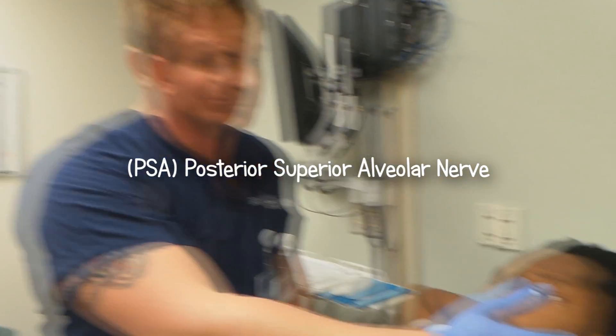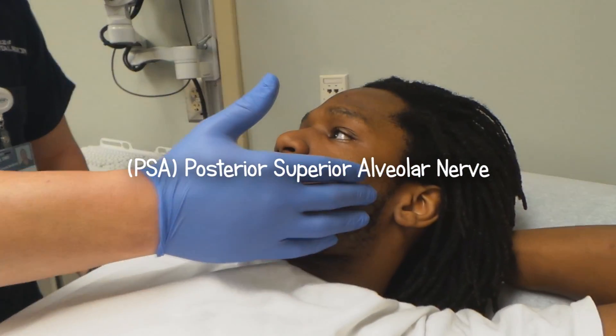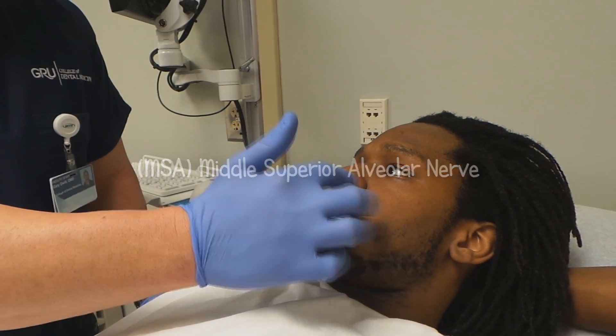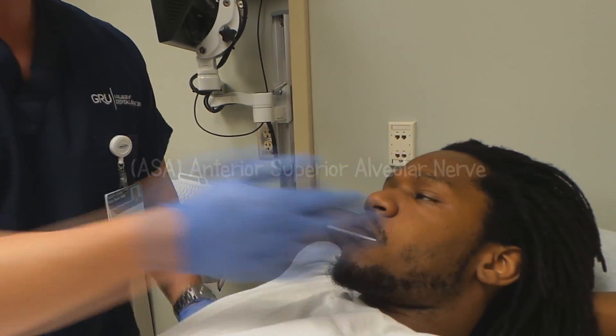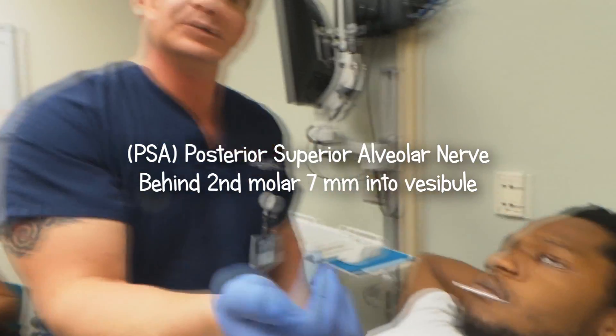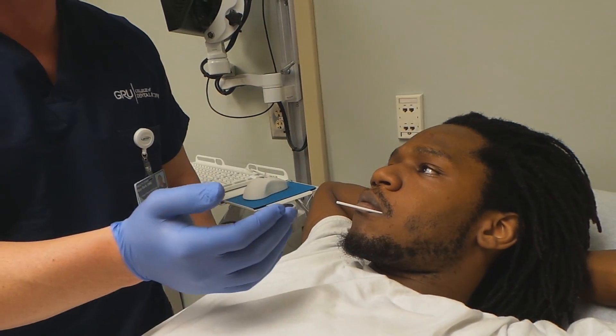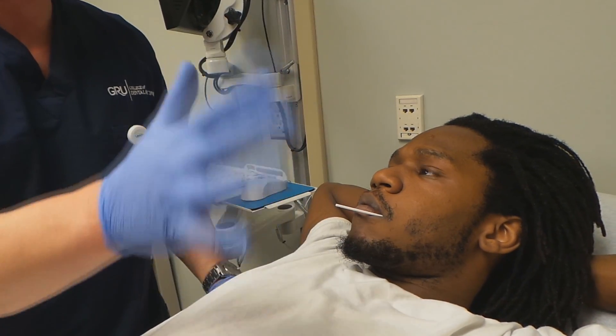So you have your upper teeth. It consists of three different major nerves: the PSA, which is the posterior superior alveolar nerve; then the MSA, the middle superior; and then the ASA. For the PSA, you want to get behind the second molar, then take the needle and infiltrate the vestibule about seven millimeters up in there, and then place the injection — that will block the nerve.